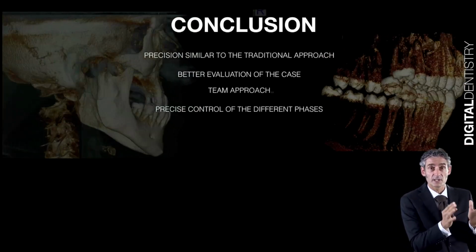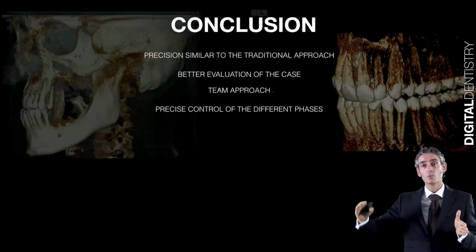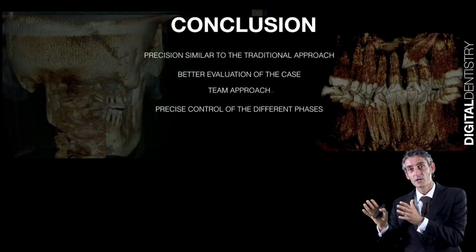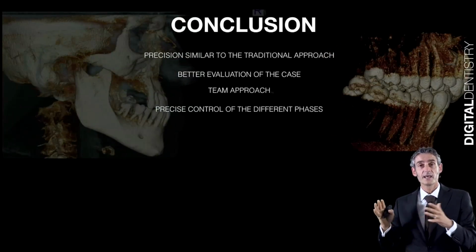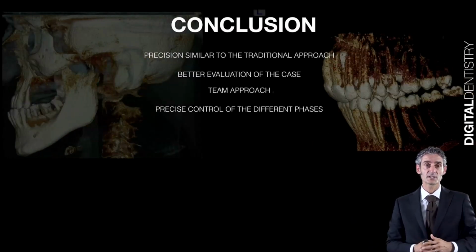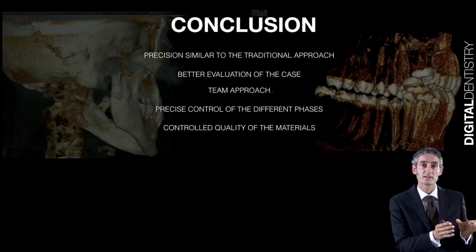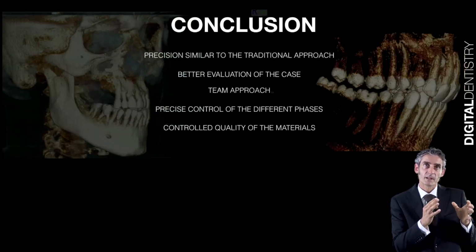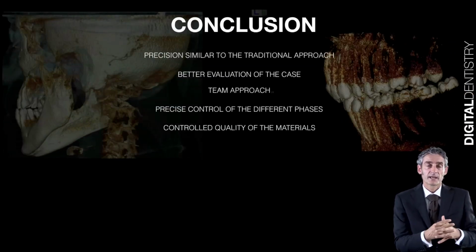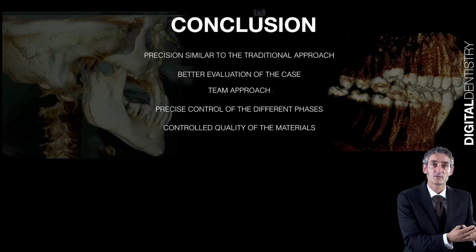For example, in orthodontics, if we take an impression in the beginning and see where we are moving, in which direction, we can see exactly where we got the target, when we get the target, and when we are ready, for example, to go for the final part of our rehabilitation, if it's a prosthetic rehabilitation. And for sure, when we speak about material, we can have materials that are in some way good materials. It's not something that is created by the technician that sometimes can have some problems. So every single time we involve the human being, we can have more error.